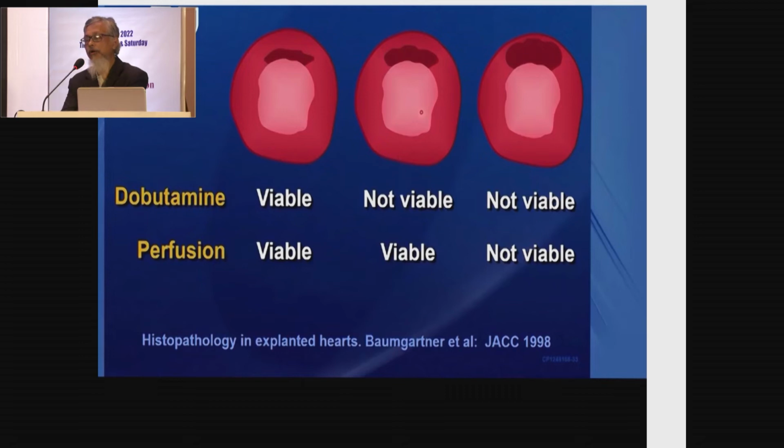For a patient with myocardial infarction, if we really can bring some meaning to their life, there has to be viable myocardium of more than 50%, which again cannot be that much assessed by nuclear imaging. So the ultimate frontier for a patient with myocardial infarction is, as has been said, the MRI.